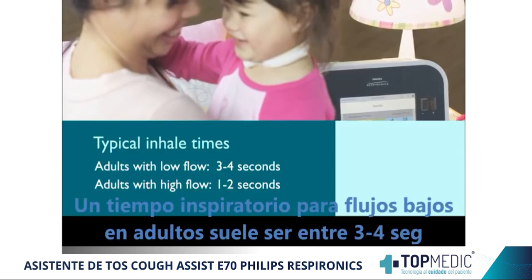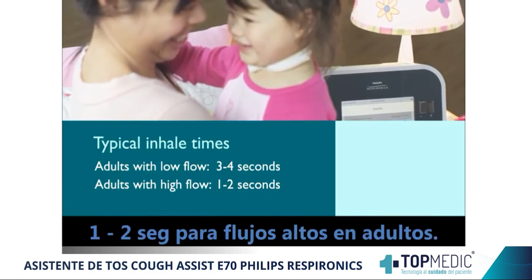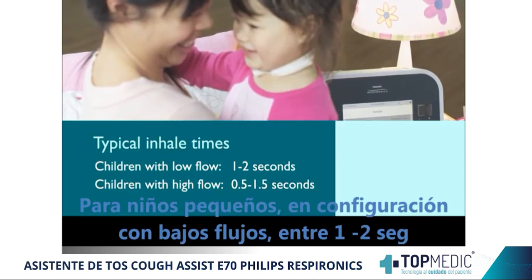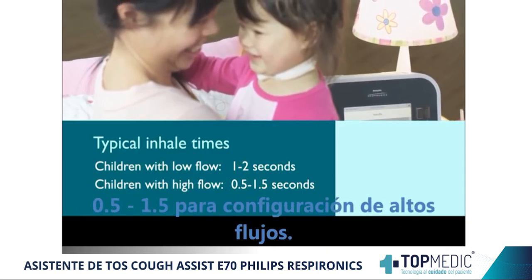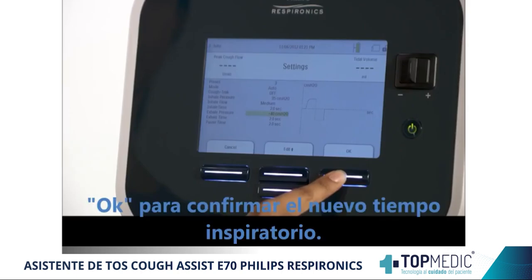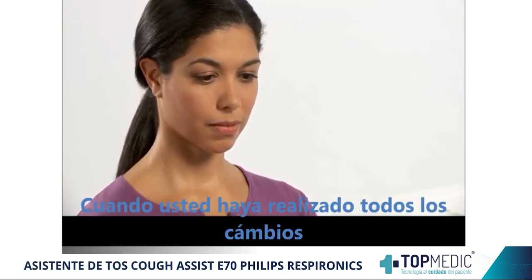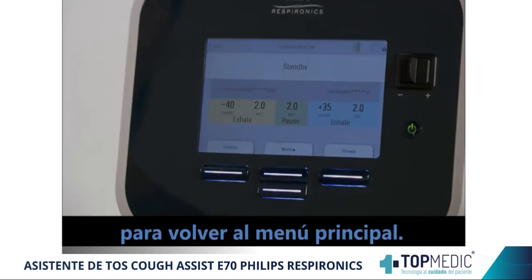A typical inhale time for adults with a low flow setting is 3 to 4 seconds, 1 to 2 seconds in adults with higher settings. For small children with low flow, 1 to 2 seconds is typical, 0.5 to 1.5 for high flow. OK accepts the new inhale time. All the settings listed can be adjusted in this manner. When you have made all of your modifications, press the left button under Finish to return to standby.